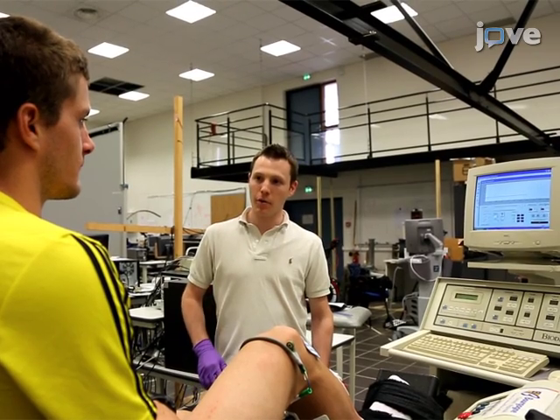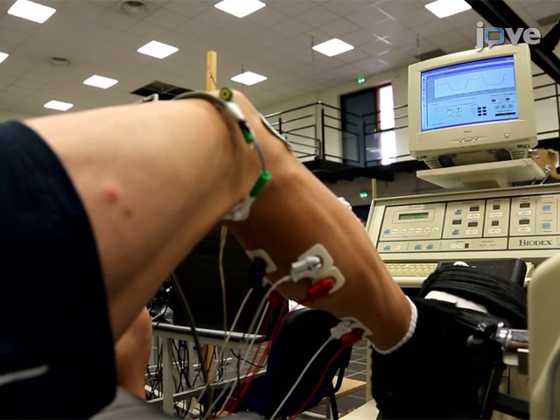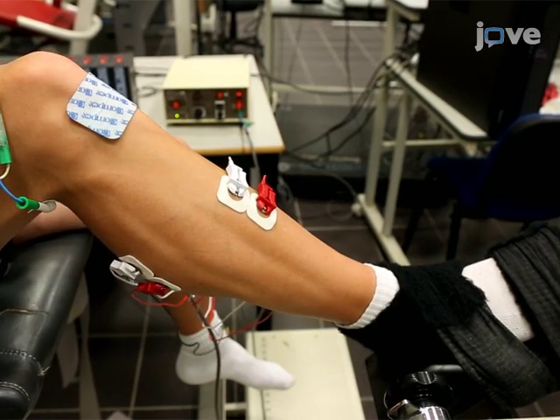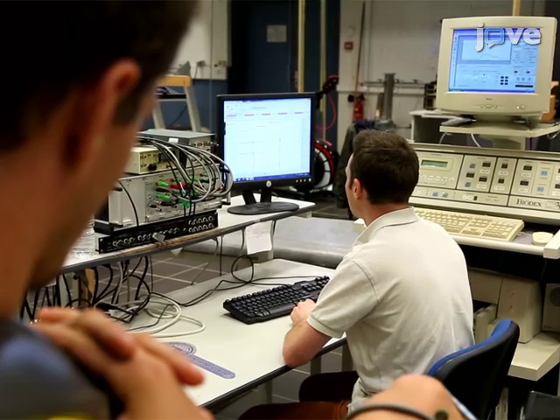For the voluntary contraction test, begin with a warm-up. Ask the participant to perform 10 brief, non-fatiguing, submaximal contractions of the plantar flexor muscles, waiting a few seconds between each contraction. During the warm-up and throughout the test, record the triceps surae EMG activity.